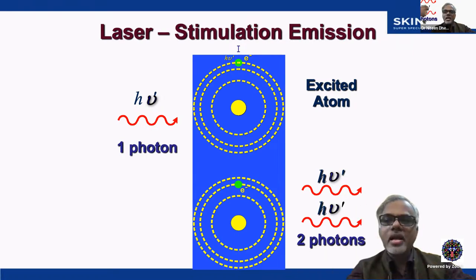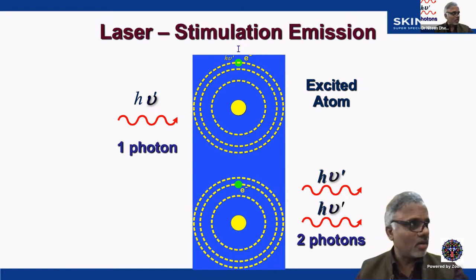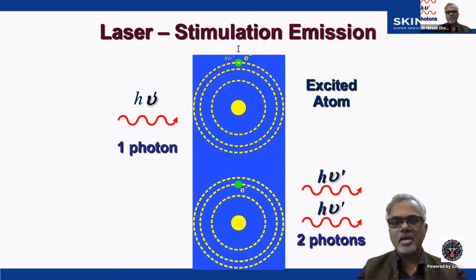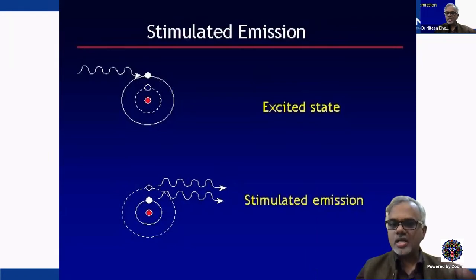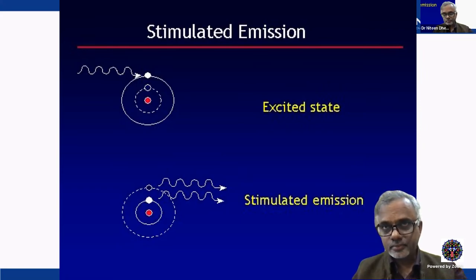So they absorb one photon, one packet of energy, and they become excited. The electron goes from the ground orbit to the last peripheral orbit, and becomes excited and unstable. That throws two photons out and becomes stable again, coming back to the ground state. So the excitable molecule absorbs a photon, throws two photons out, and becomes stable. Another thing is, here the excitable atom or molecule absorbs one photon of any color, any wavelength, but it throws out two photons of the same wavelength.